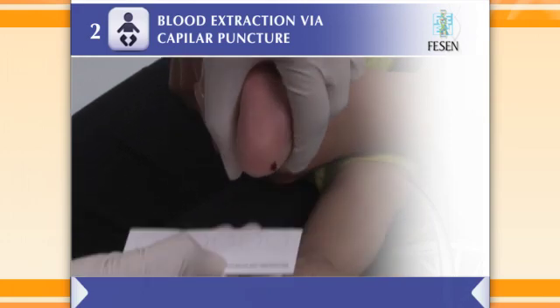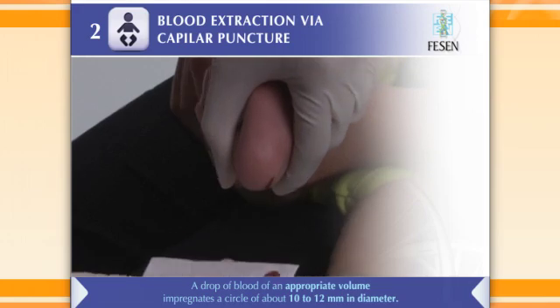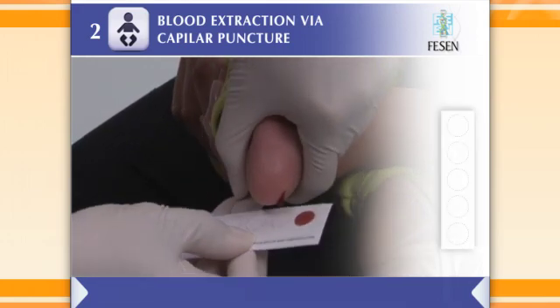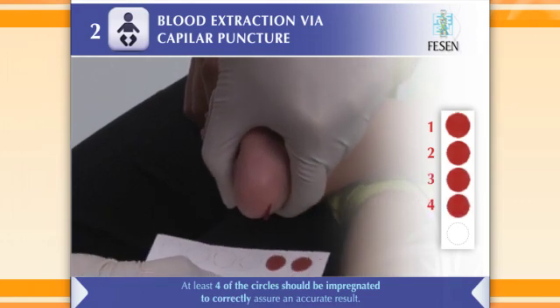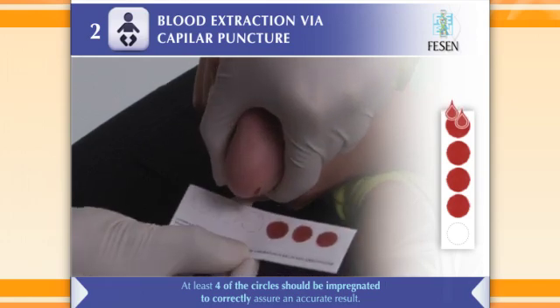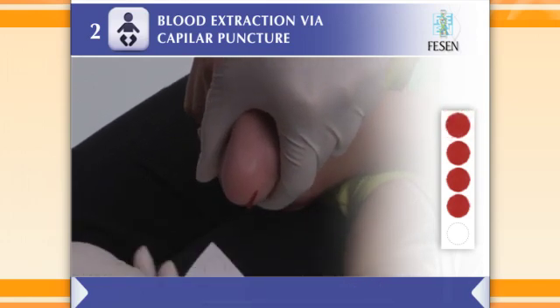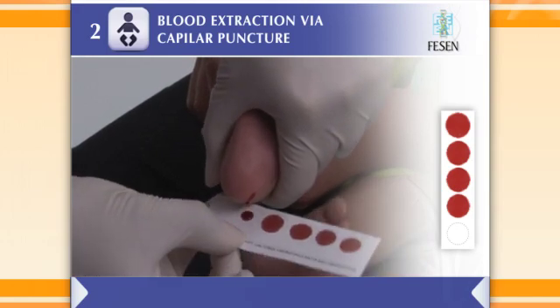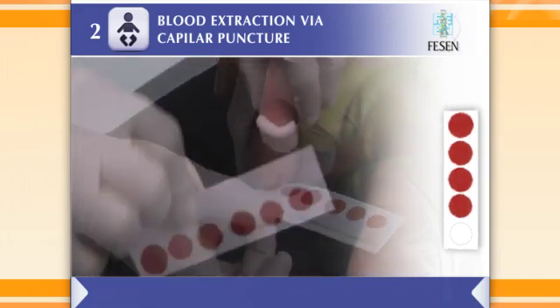Allow the drop of blood to touch slightly the filter paper and to spread on it. Repeat the procedure to fill the remaining unfilled circles. Do not overfill the paper by applying more than one drop of blood per circle. Ensure that the drop of blood absorbs uniformly onto the filter paper and that it appears on the side opposite from where the drop was applied.